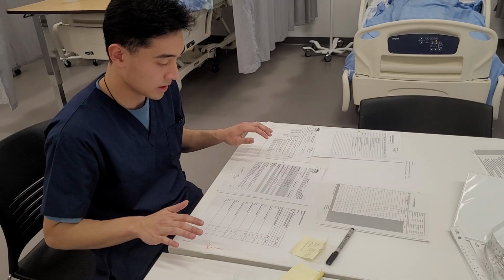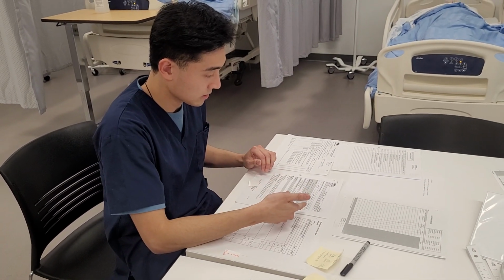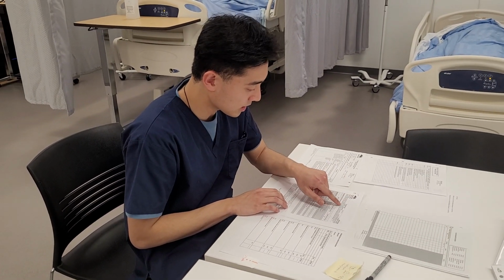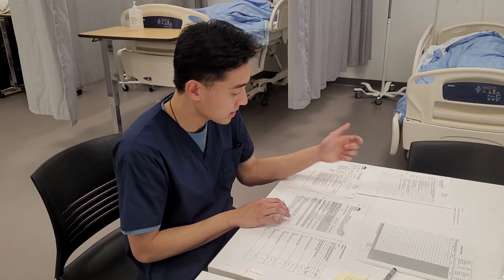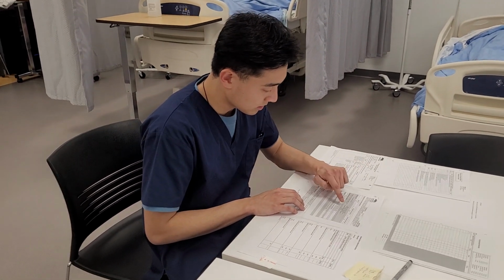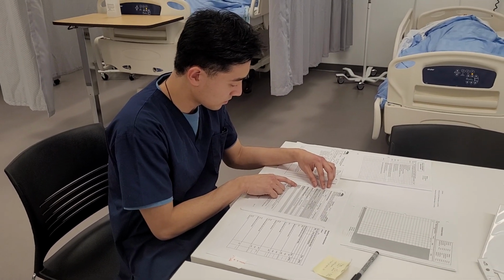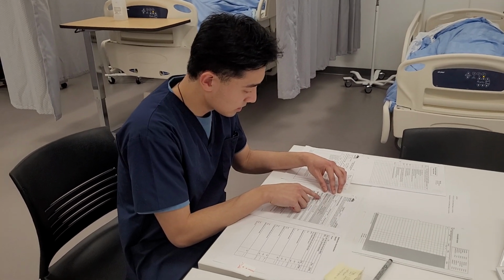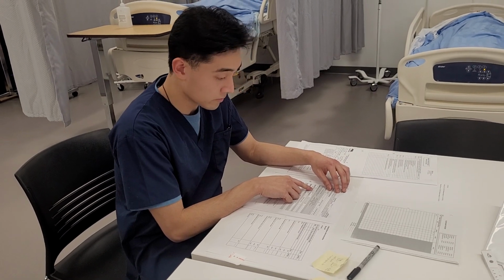So after I've checked my medication, I'm just going to go over to the IV monograph. Cefazolin is a cephalosporin, and I'm going to make sure that there's no monitoring required. This medication is to be given over 3 minutes.